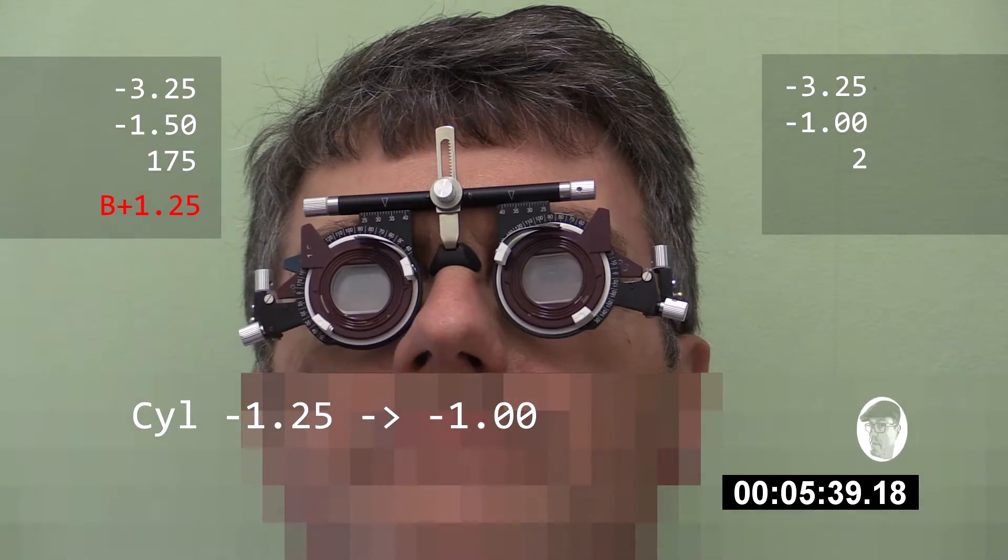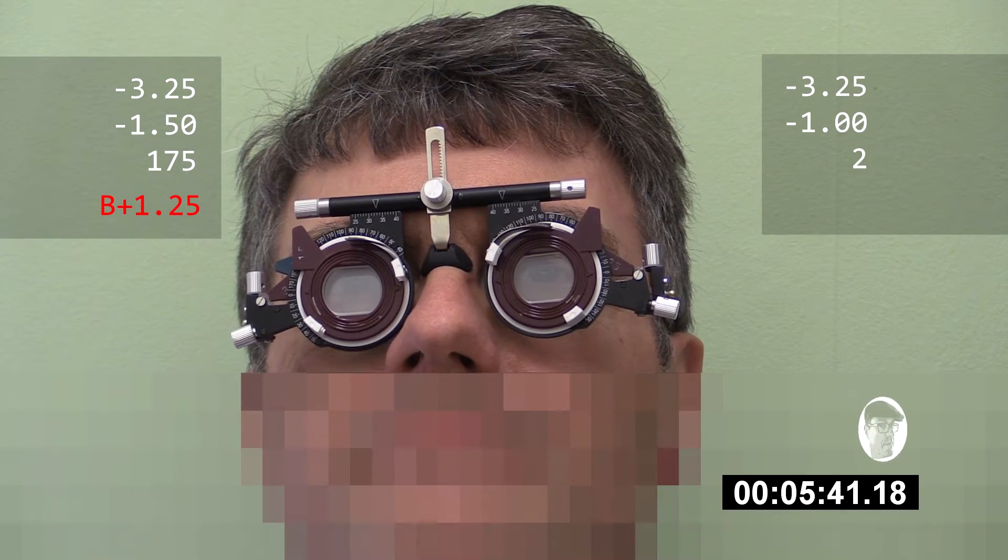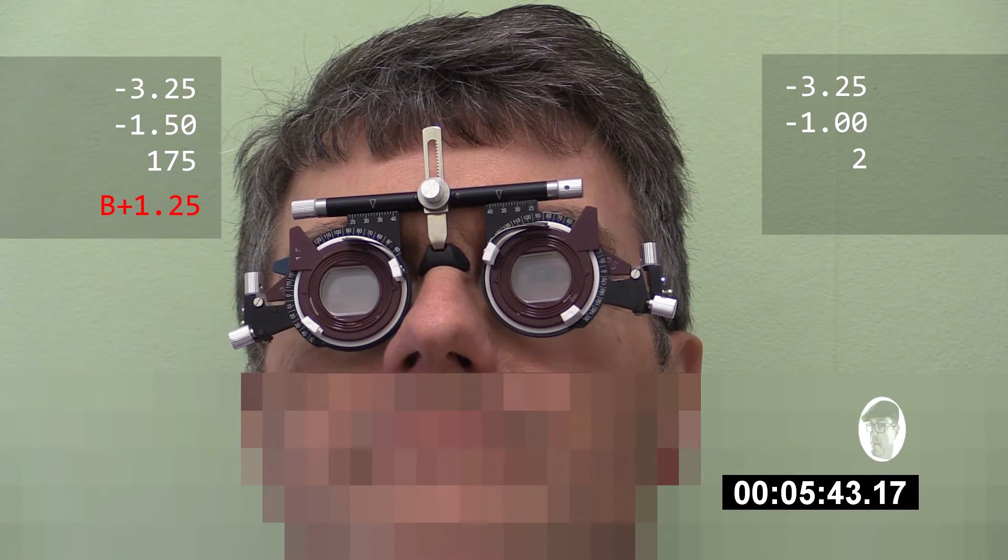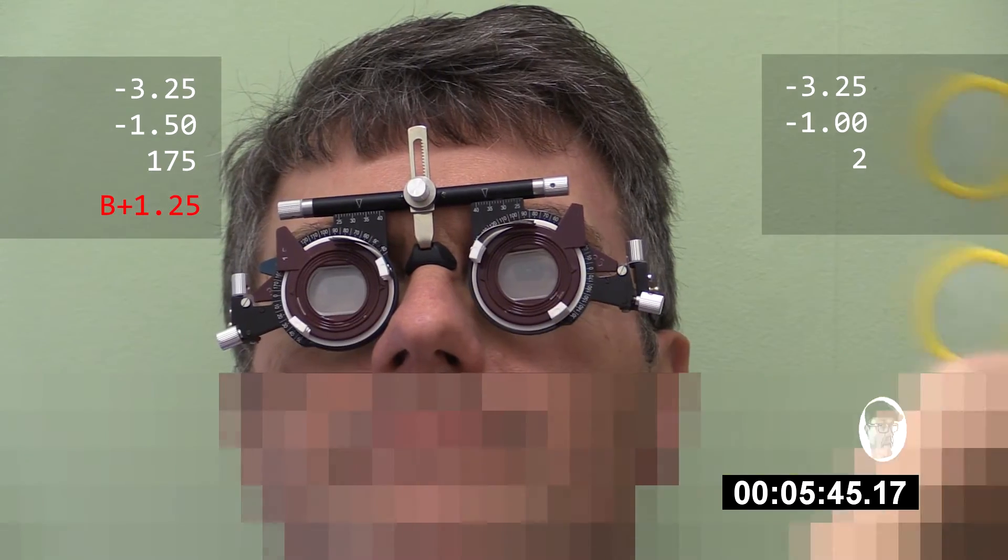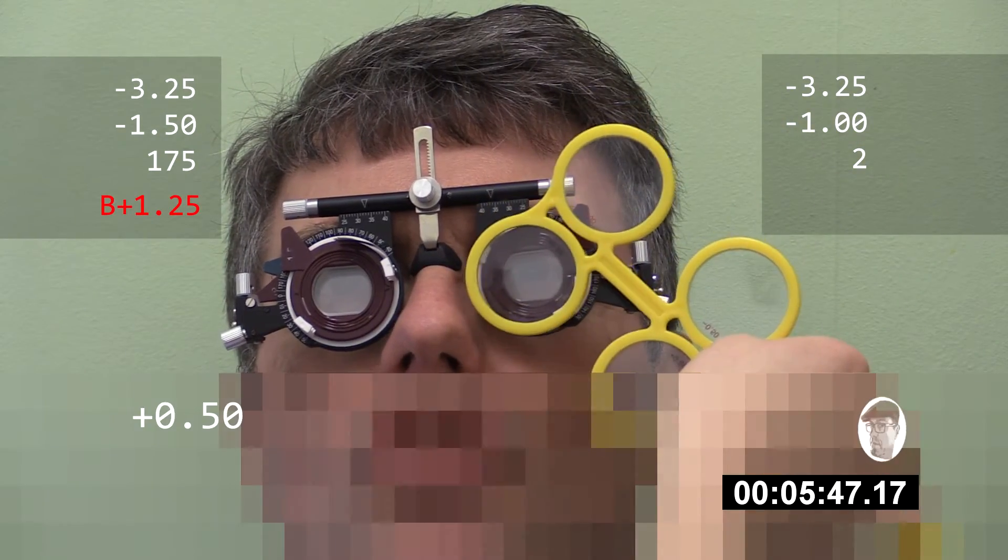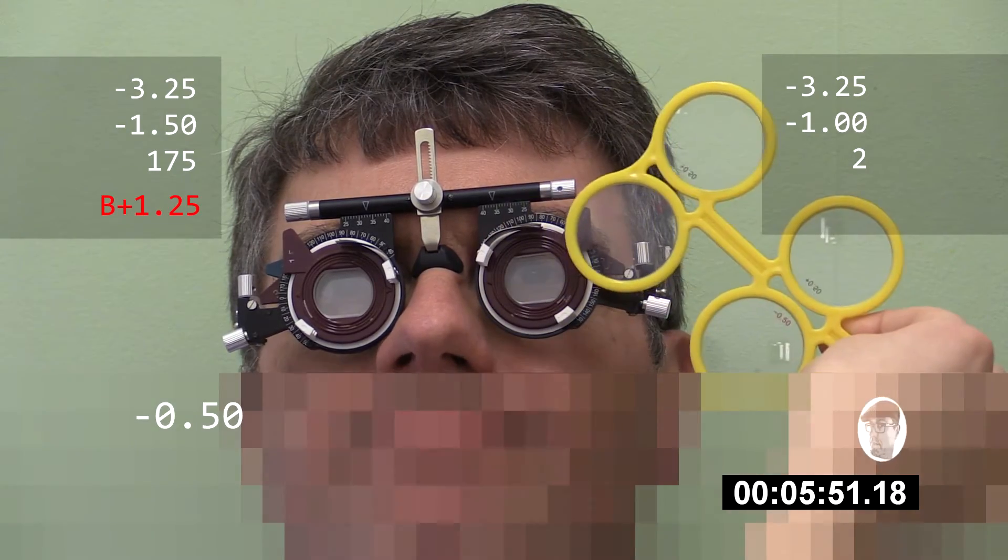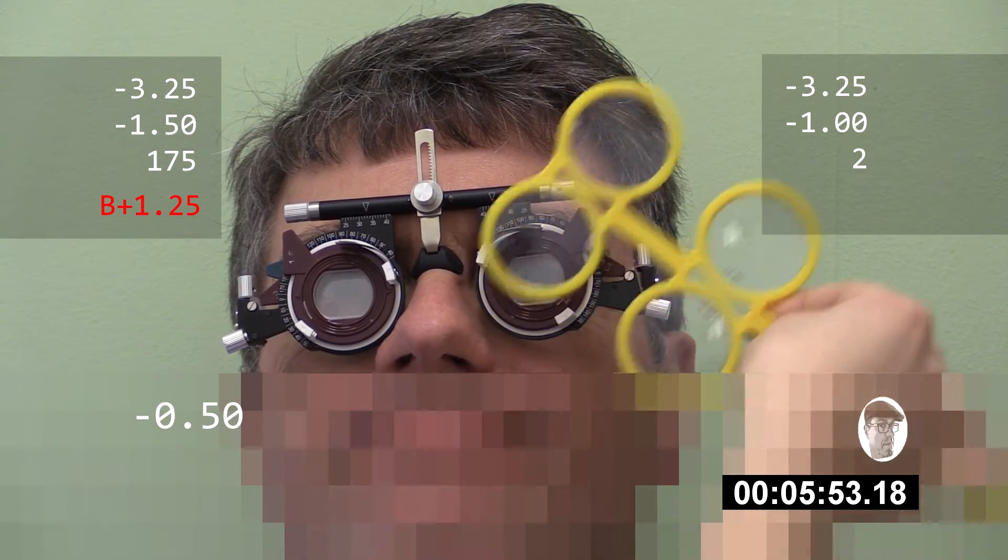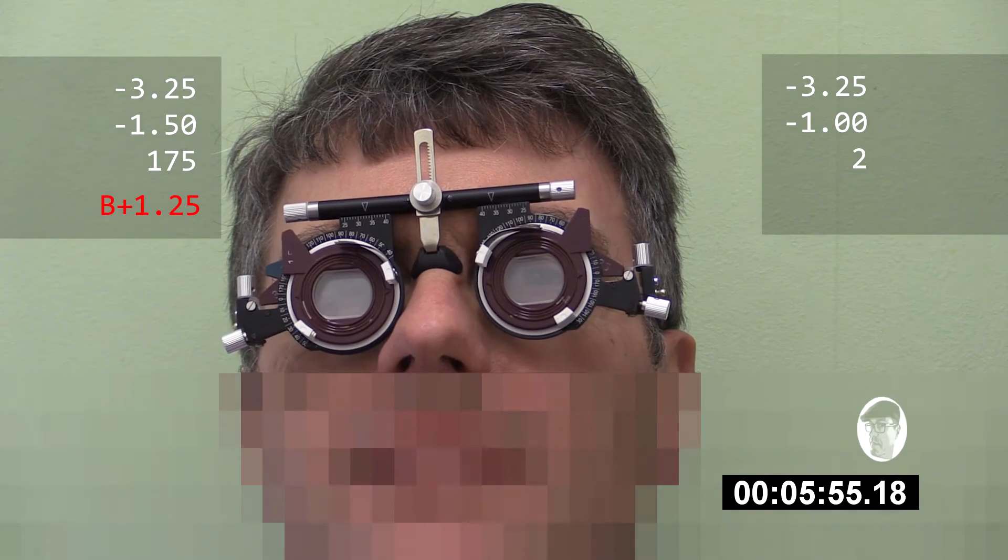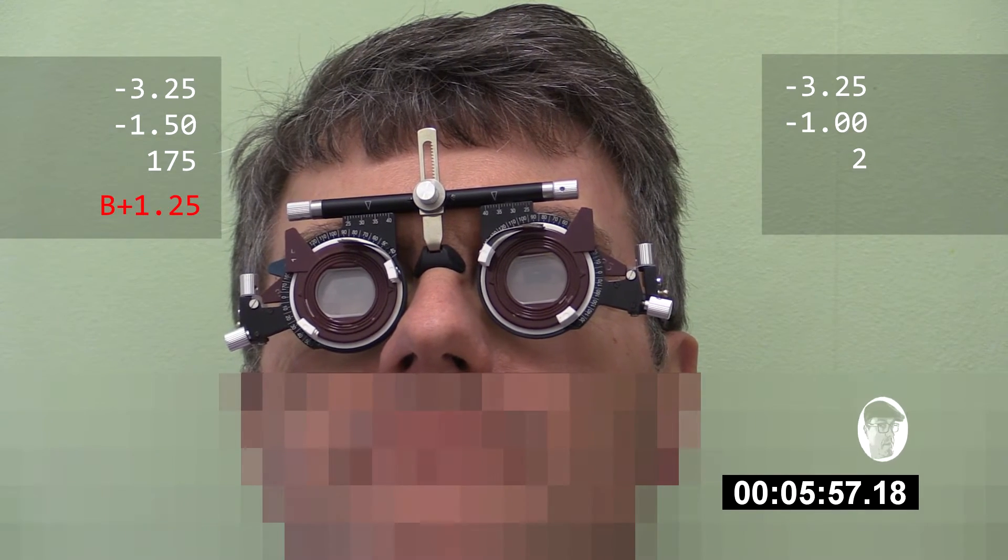Okay. And looking back at the chart, are those letters on the chart, the smallest that you can see, any clear with, without. And clear with or without. That's with. Worse with, yeah. Worse with. Perfect. Okay.